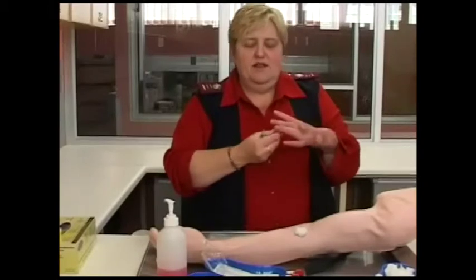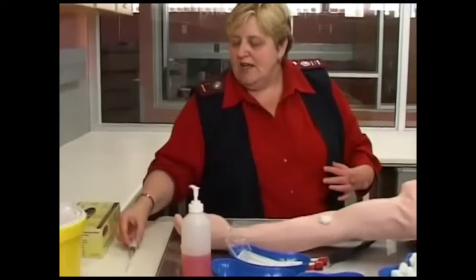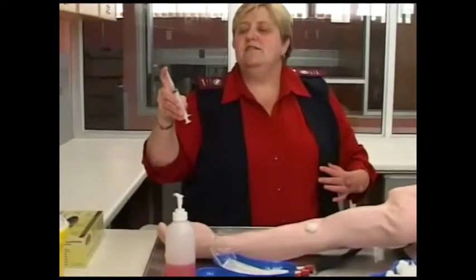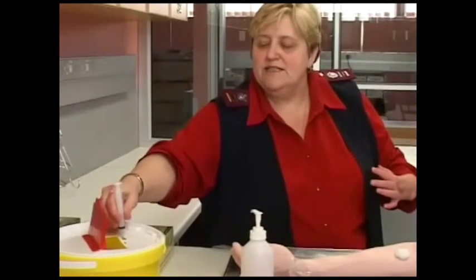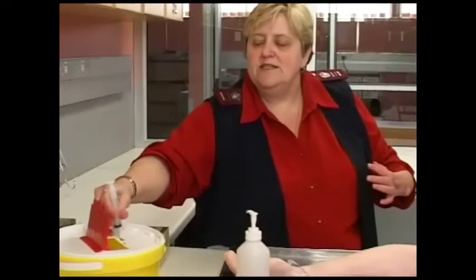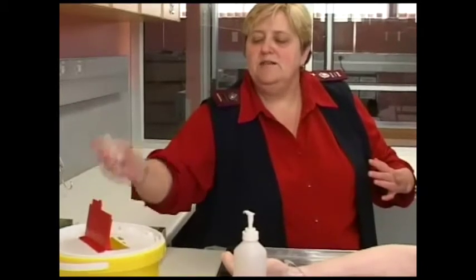Remember, recapping is one hand only — always use one hand. You take your syringe and pick up the cap with the needle and it is recapped, but only when you don't have a sharps bin with you. When you do have your sharps bin, always throw the needle inside it by inserting the needle into the opening until it's stuck, then turning it anti-clockwise until it comes off and falls in.